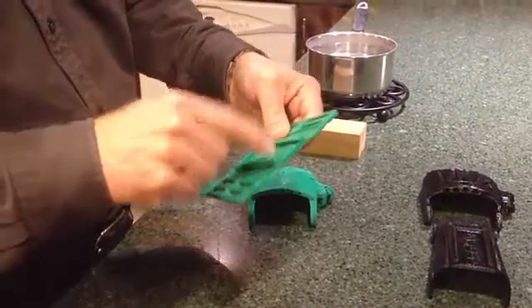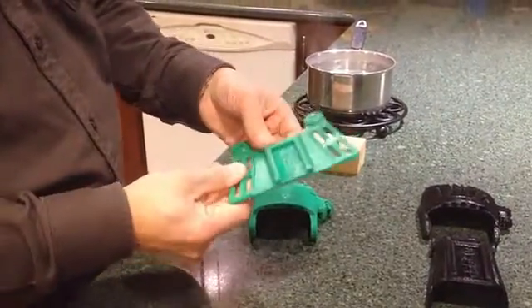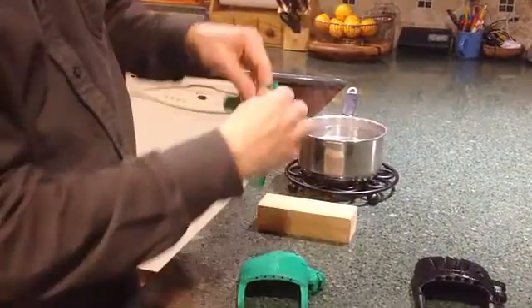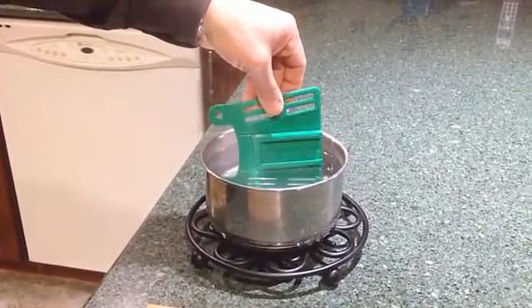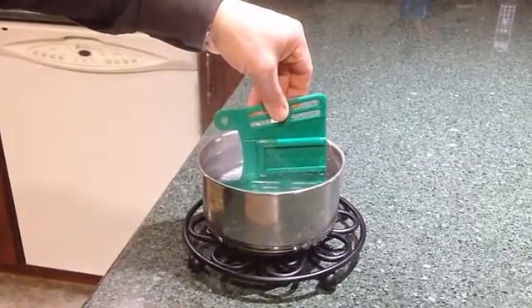The dovetail section in the middle — I don't want to be bending that. If I distort it, it won't fit the gripper box on the back properly. So I'm going to dip it in the hot water up to, but no further than, the edge of the dovetail. I'll dip it in this recently boiled water up to that line for about 10 seconds — it doesn't have to be exactly 10, but something along those lines.